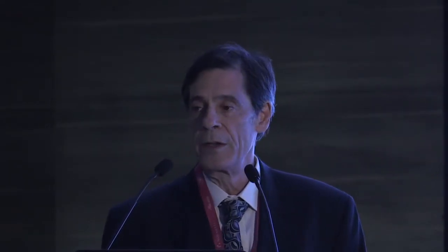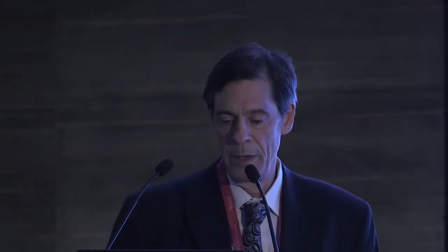So for the en face reconstruction, it's derived from the B-scan. The thickness of the ellipsoid zone is measured, and you can set a thickness threshold, and below that threshold, you would consider that the ellipsoid zone is disrupted, and then you can display that as a 2D map. So on your left, you see that this image was segmented automatically by the software, and then the series of B-scans was then redisplayed in this 2D image. You can do this in 3 dimensions, which you see here, or do a binary map, and then you can monitor this over time and look at the change in ellipsoid zone loss over time.